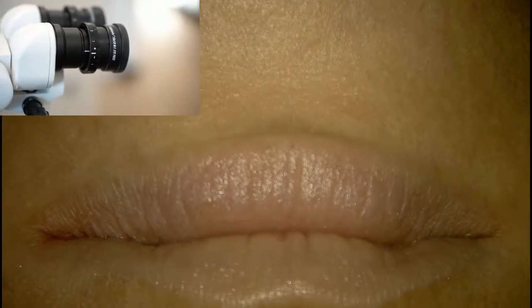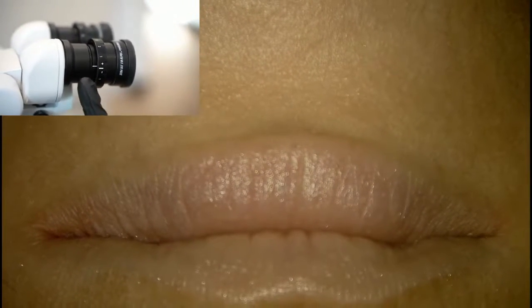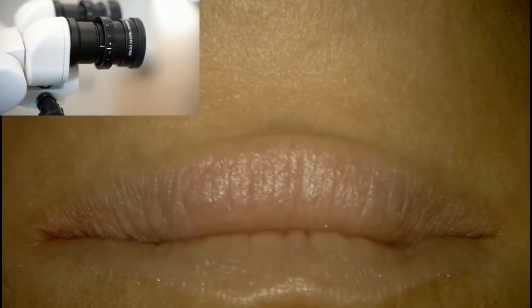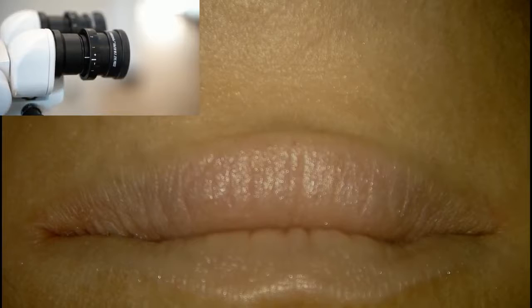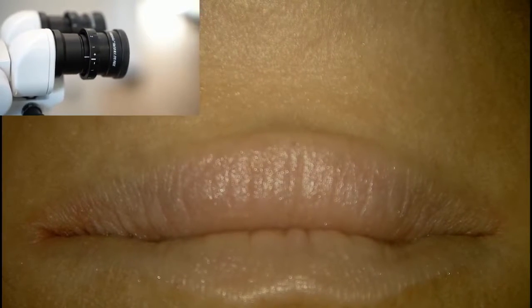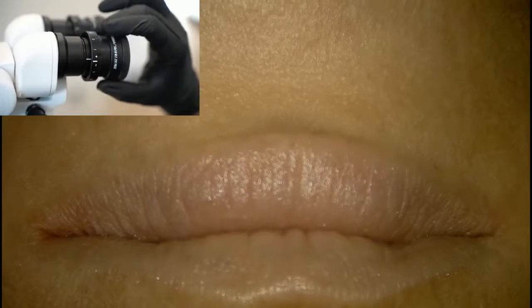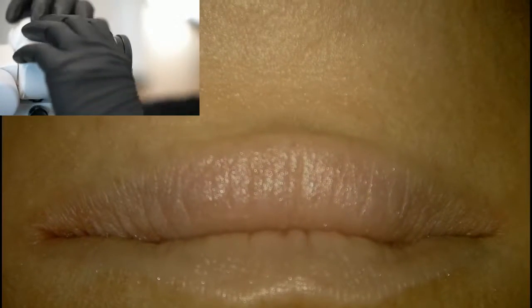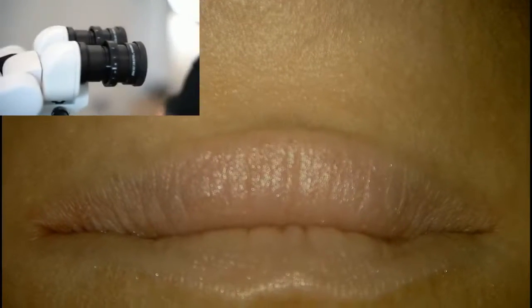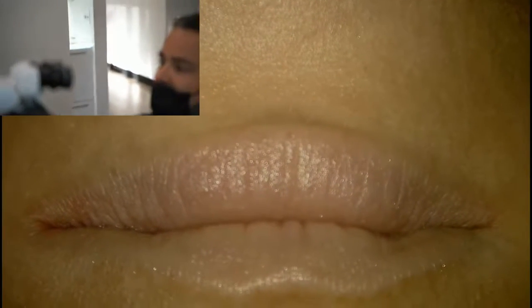There's a lot of things to this. There are actually different magnification levels that you can pick in the eyepiece that affect how magnified things are. In endodontics, I'm always working at a really magnified image. The other thing is your interpupillary distance can be corrected like here.